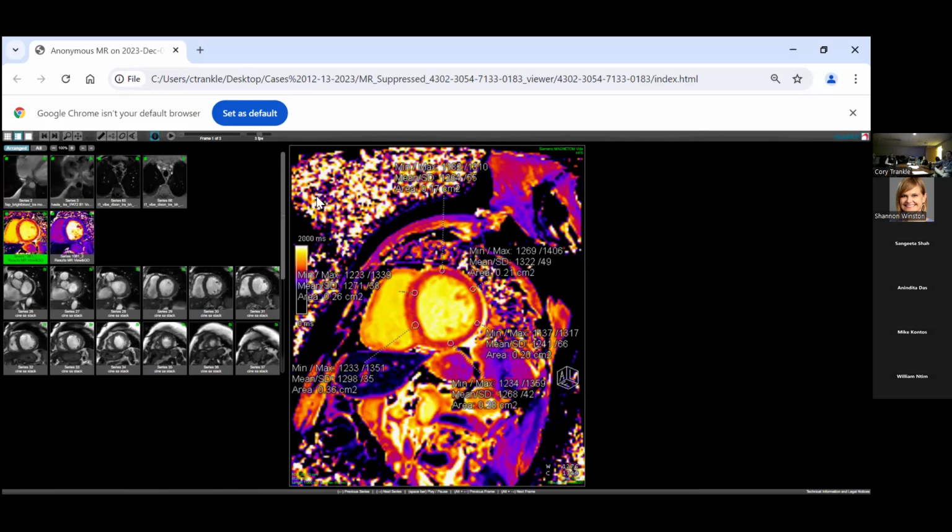Those are called pixels. You have those on all your screens. Pixels are defined in two dimensions. Just like a square, you have one axis, we call them length and width, something like that, right? You think about when you were doing geometry. Think about a square. You've got the length of one side of the square, and you've got the width, or you have a rectangle. So most of these are going to be squares. Those are called pixels.